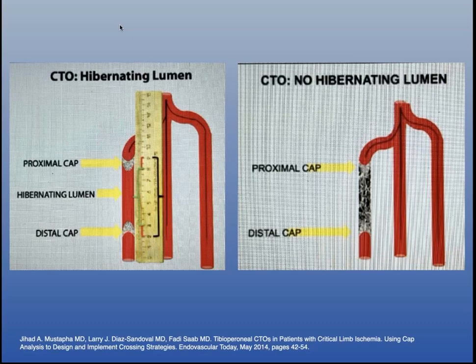But remember that in a hibernating lumen, you have a proximal cap, a distal cap, and in between is open. And that is hibernating because it's angiographically occult. You don't know that until you start your recanalization. Sometimes you can look with ultrasound, that may give you a clue.